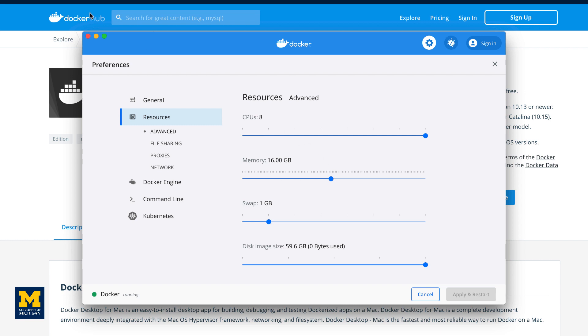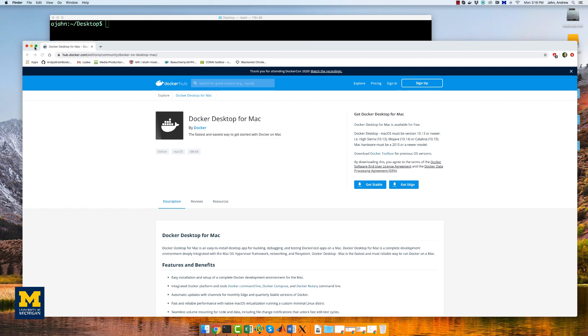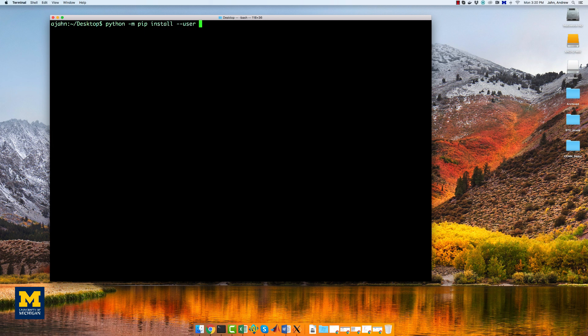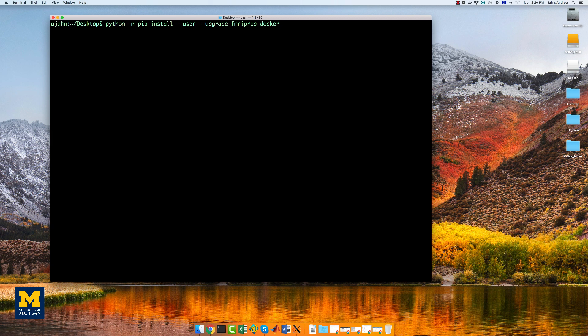To activate the fmriprep containers, we need to use pip to install the necessary packages. This is the line of code you'll need to type. I've already done this, so again, I'm not going to reinstall it again. But this will allow you to use the fmriprep command.